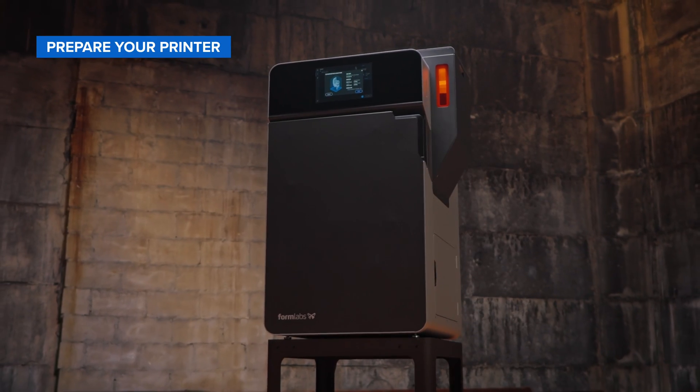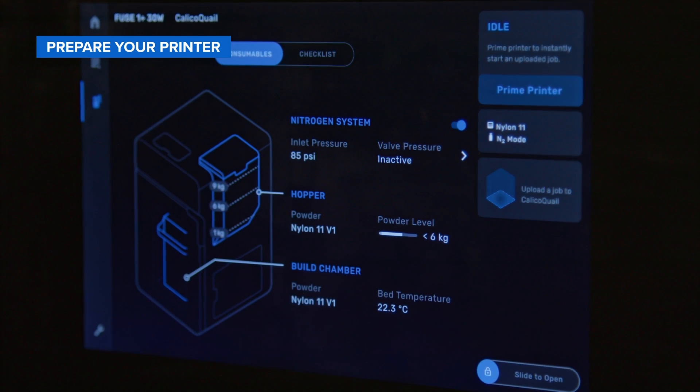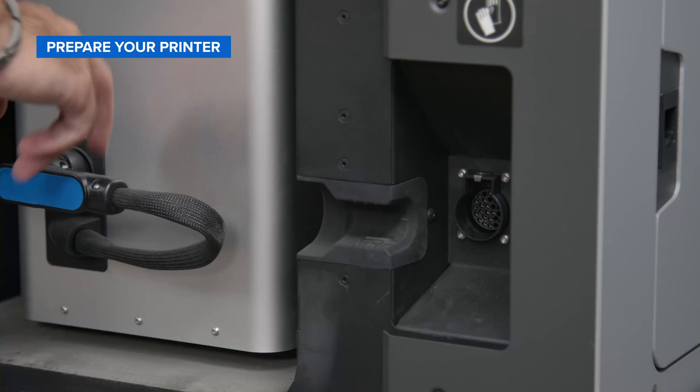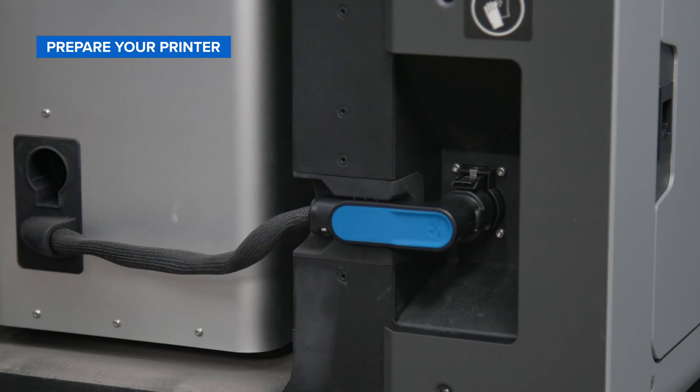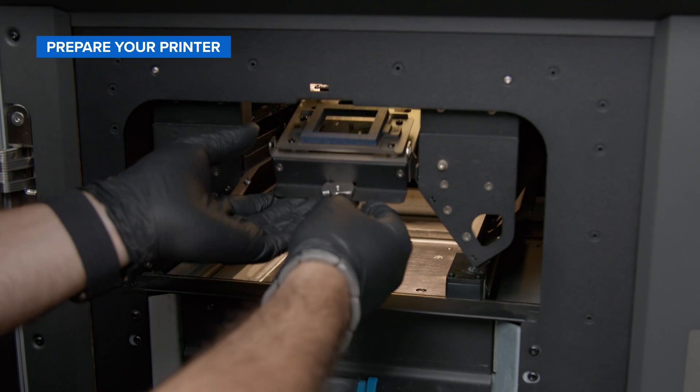Now, let's prepare your Fuse 1 Plus 30 Watt printer. On the touchscreen, you'll be guided through the following steps. First, insert an empty build chamber into the printer. Connect the build chamber plug to the printer, ensuring that the left side of the plug is flush with the printer frame. Insert a clean optical cassette into the printer.